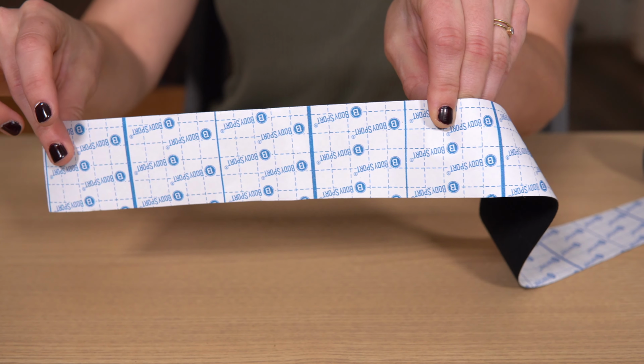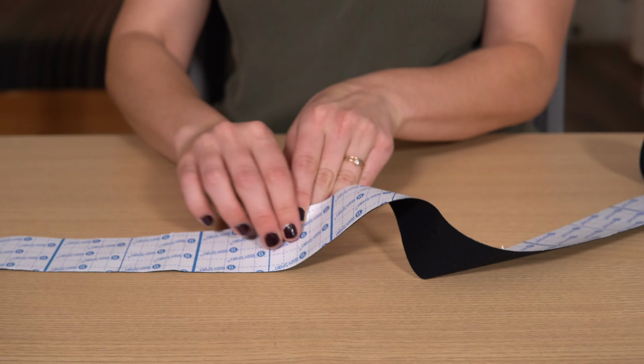I'm cutting just slightly shorter than what I'll need because I am going to be putting a bit of a stretch on this. So you don't want to measure exactly from point to point, otherwise it's going to be a little bit too long. So cut your K-tape to length.